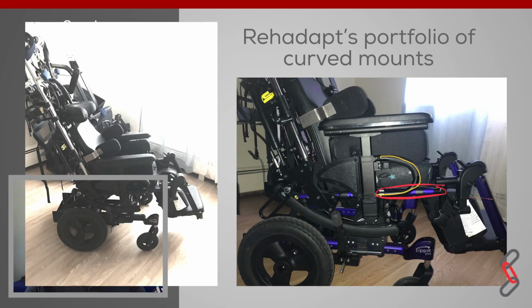This is user number 5, another customer example. So this is also a pediatric chair. You can see there are some pillows on the side. There is a construction here on the headrest that will hold the head good enough. There are some footrests, and also here it is requested to mount an eye gaze system. Also here we need to find a solution.